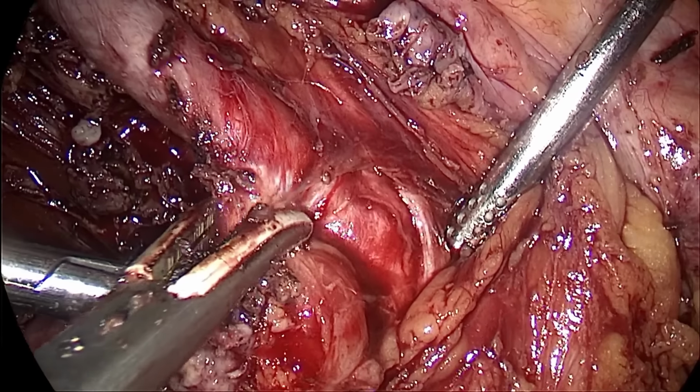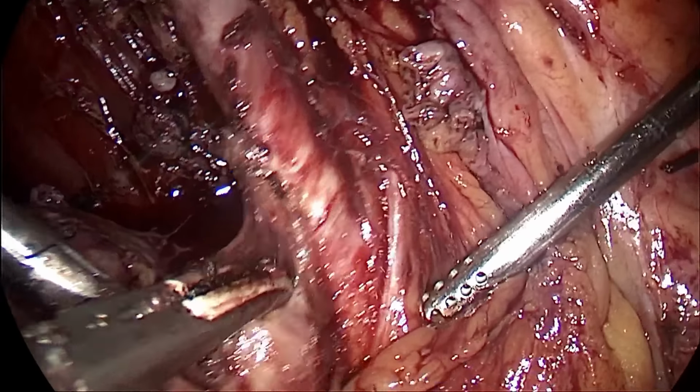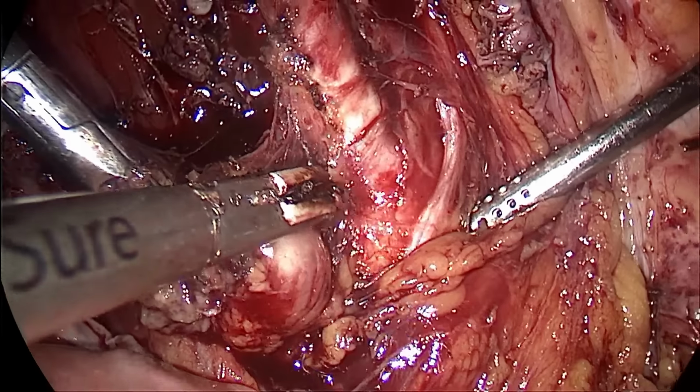So with the suction, I am pulling the ureter away. So he is lucky enough to get a plane between the vessel and the node.